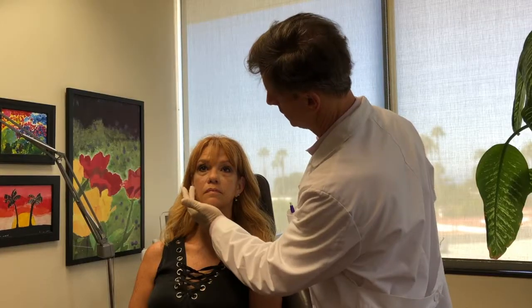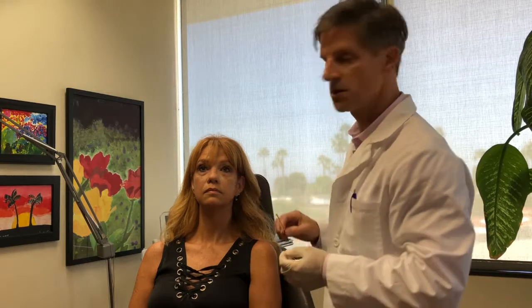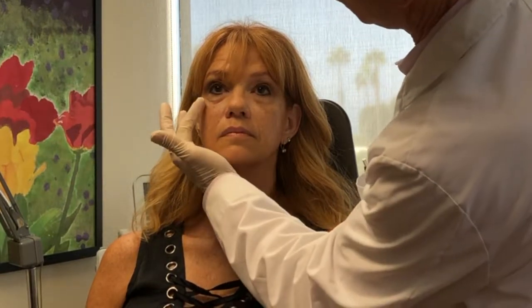We can clearly augment this area somewhat more. The tear trough we have not addressed — this can be addressed with a low G-prime filler such as Volbella, but when fat pads are prominent, I personally prefer a surgical excision of this area. The augmentation of the right cheek shows a clear difference now between the left and the right. More volume can be added if desired; what I have simply done is restore that nice cheek contour, which would not be obvious to anyone in terms of having anything done.